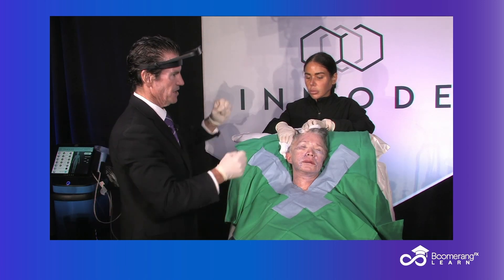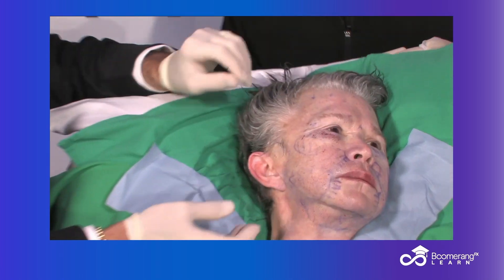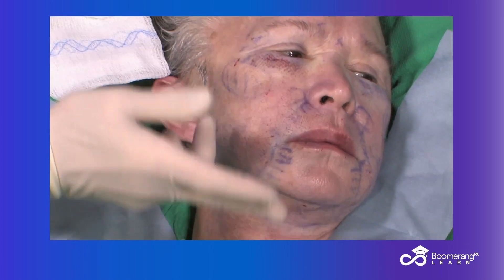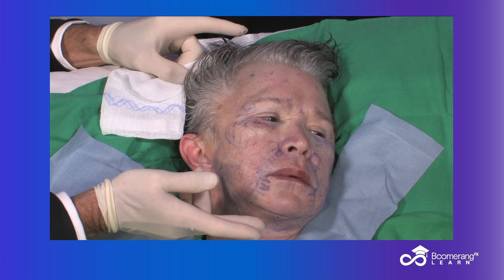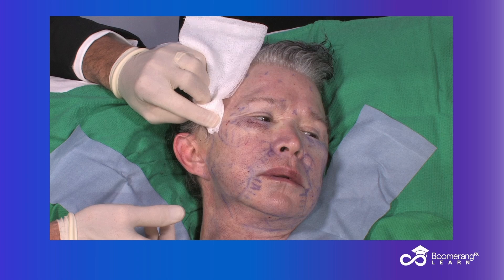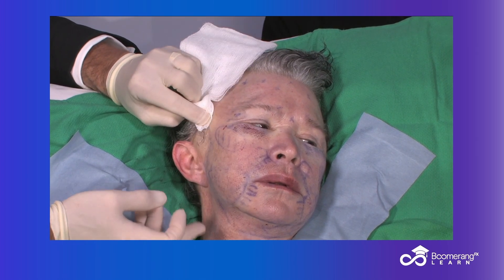So here's our young lady. Let's zoom in so we see from here to here. What do I want to achieve? Show me the bottom of the face. That's what we want right there — see the shift in our malar fat pad, jowl, and jawline? That's what we want.